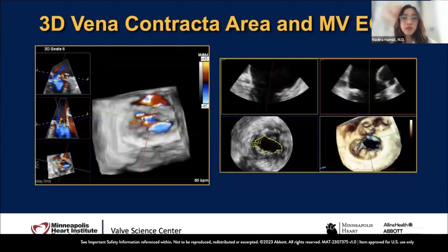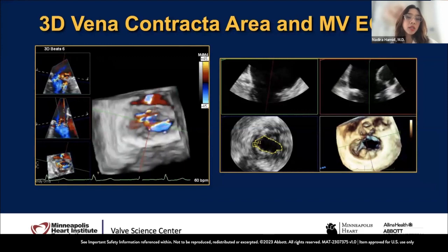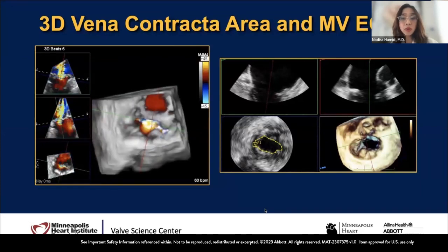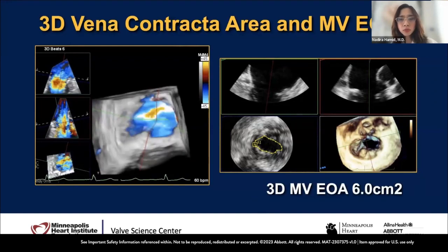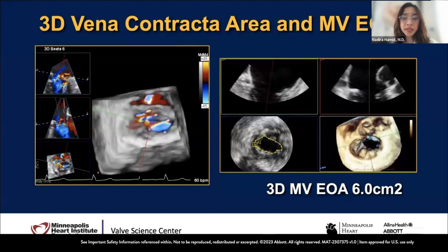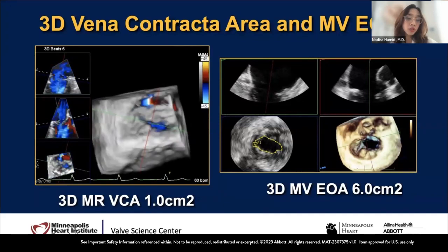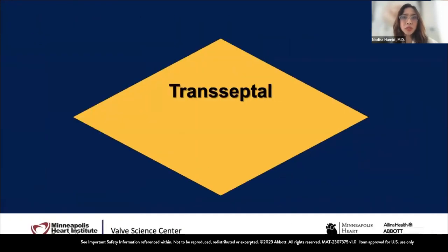So here, the 3D vena contracta area, you can see is an acquisition over six beats. There may be stitch artifacts, but on the table, you can ask the anesthesia to have the patient hold the breath while you acquire this. And on the right-hand side, you do a mitral valve area planimetry using the 3DQ software on the console of the machine. And here it's certainly adequate enough. Anything more than 4 is adequate. And you can see the mitral regurgitant jet all along the commissures with a large vena contracta area of 1 centimeter squared. Certainly beyond severe, to me, would be torrential.